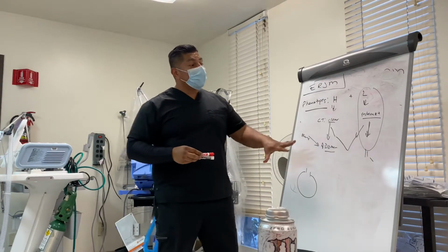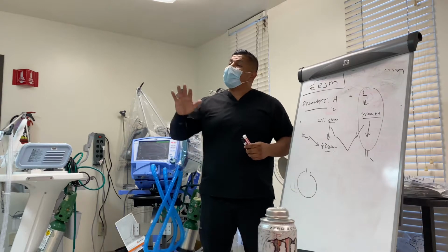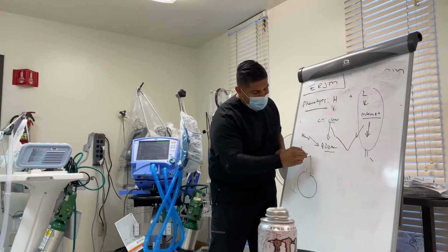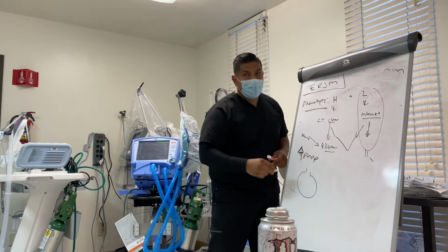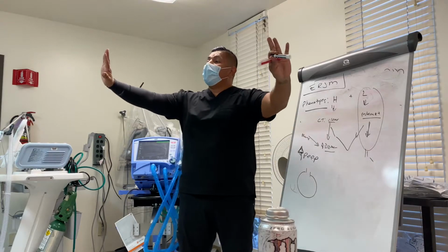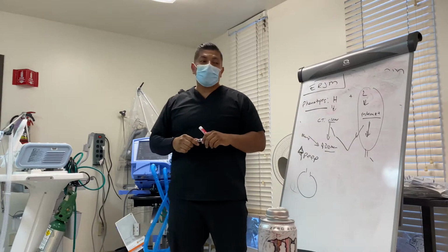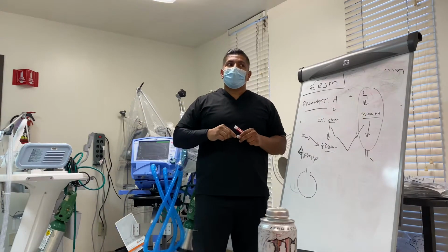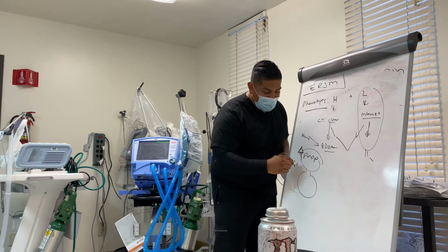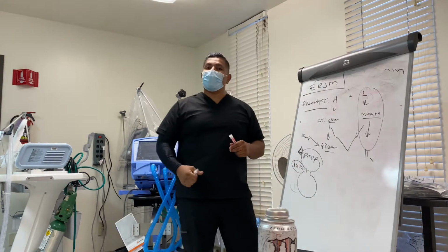So when your shearing is so bad that you're forced to go into lower tidal volumes, how do you minimize the shearing on the alveoli? Keep your PEEP high. High PEEP will not allow for that shearing effect constantly. It keeps it open. Exactly. Which is why part of the ARDS-NET protocol is high PEEP, low volumes, and a high rate. Rapid shallow breathing at a high PEEP level.